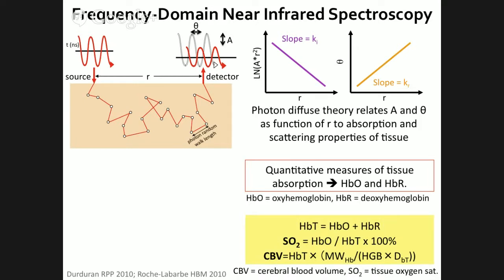Any other questions? What's the smallest area of the brain you could monitor independently? Yeah, that's a good question. We've done finger tapping tests. We put the probe over the motor cortex and then put it 1 centimeter away, and we no longer are sensitive to the activation.